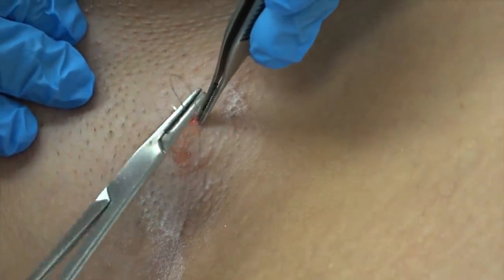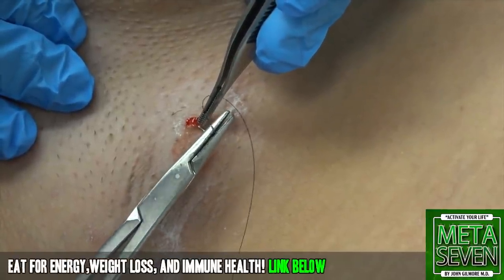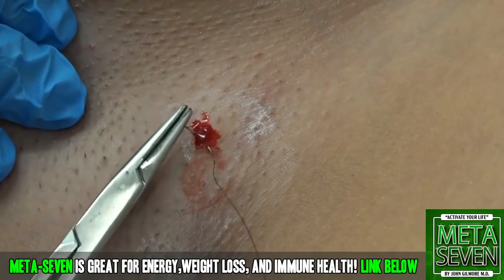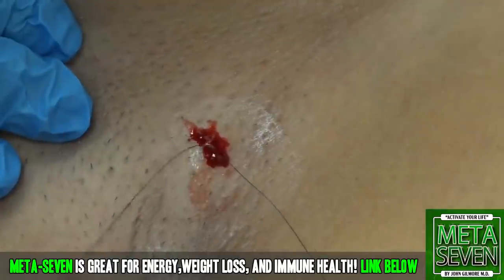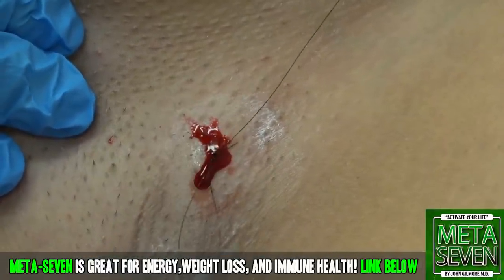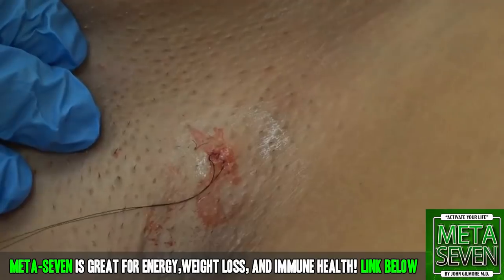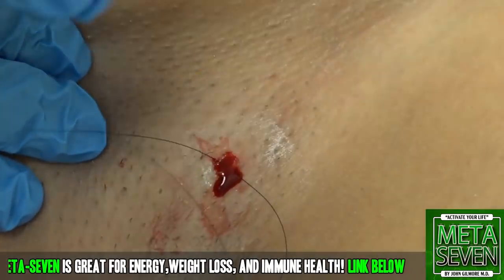Okay, there you go. Is it right here? Yes. Perfect. A little bit wider. That's fine. Go ahead right there. And then go through the other side. Ignore that giant armpit hair. Good work. Did you get through both sides? I think I did. Just pull the hair off. Did you get it deep enough? We will find out when you try to suture that up.